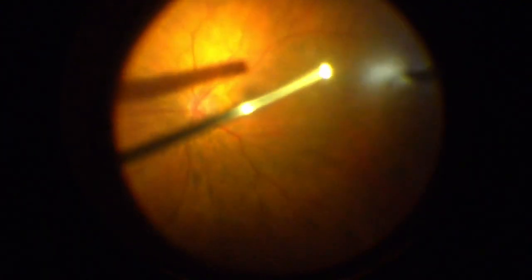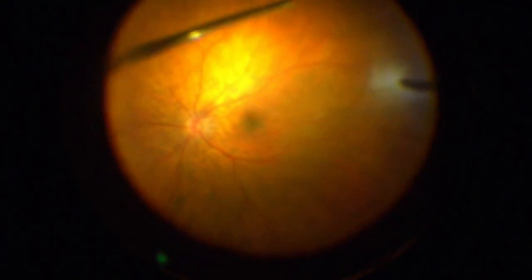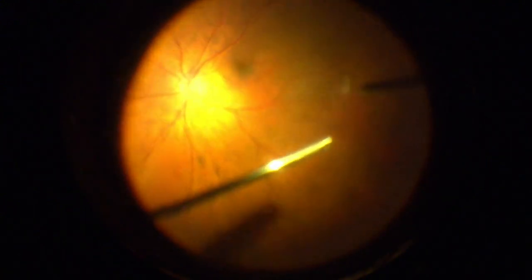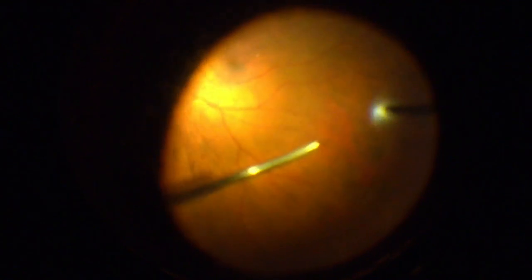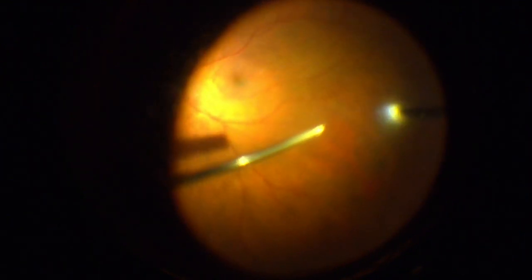And that alone, in this particular case, with her type of traction, what we already have done could actually be pretty curative. But since we do have this lamellar hole, which is probably not affecting the vision too much, it does impact how we treat the patient with the Eylea injections.